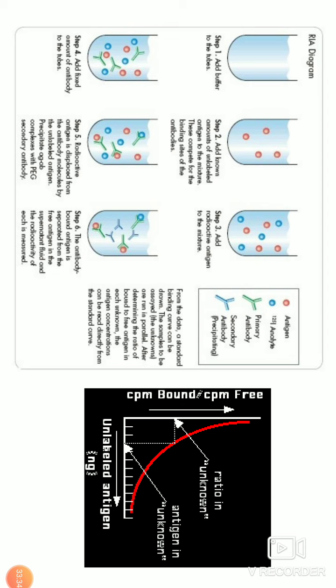Say you have taken 100 molecules of the unlabeled antigen from the sample, you have quantitated the protein, and you know how much you have tagged the antigen with radioactivity and you have added that known quantity of radioactive antigen into the mixture. And then the next step will be to add a fixed amount of antibody to the tubes. Whatever is more will always compete more for the antibody. Say you have added 20 antibodies, and now you have 100 unlabeled and only 20 or 30 labeled.